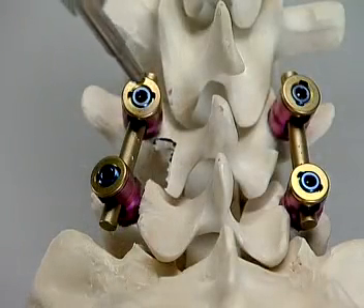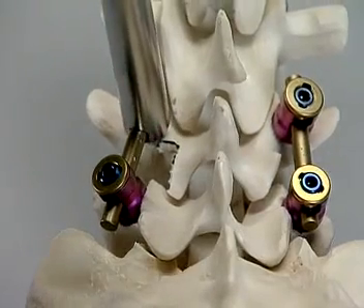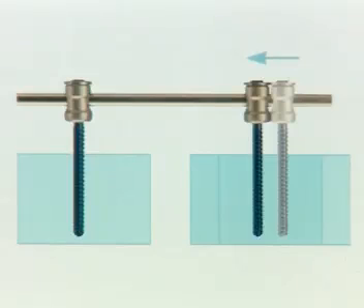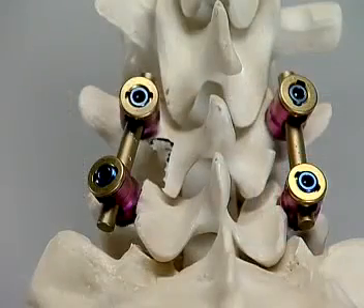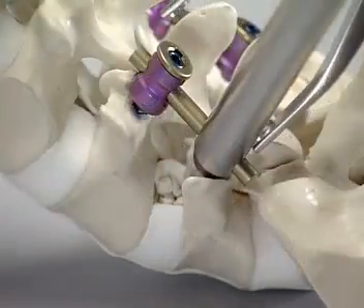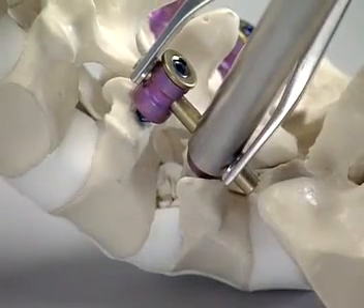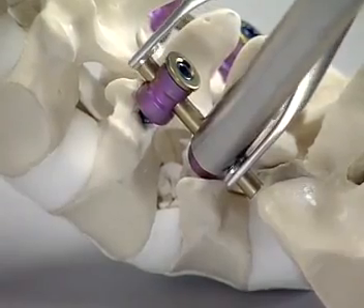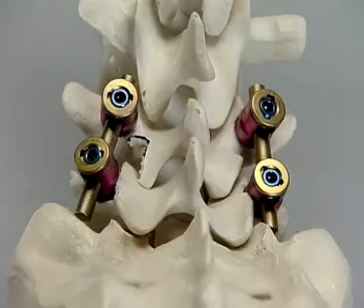The rod pusher and the hexagonal screwdriver are used to tighten the 3.5 millimeter hexagonal screw. At this stage, it is essential to apply axial compression across the cage; the compression should be parallel to the cage. A great advantage of the Cliquex is that the rod can now be loosened in the Cliquex 3D head while the 3D head remains fixed to the pedicle screw. Applying compression avoids opening of the anterior portion of the vertebral body. The cap driver for the Cliquex locking cap and the inner 3.5 millimeter hexagonal screwdriver are connected to the screw in L4, and the compression forceps is placed on the rod. Compression is applied across the Travios cage and the 3.5 millimeter hexagonal screw is tightened with the T-handled screwdriver. This procedure is carried out on both sides, promoting excellent compression across the Travios cage.